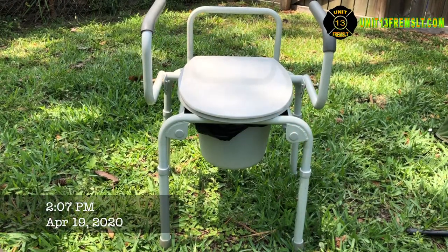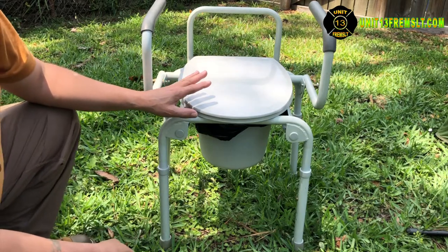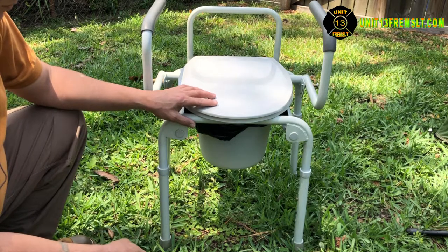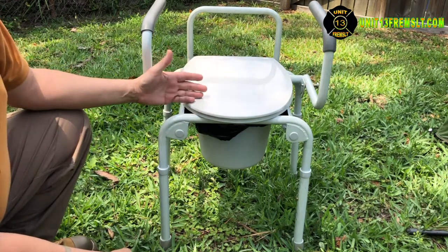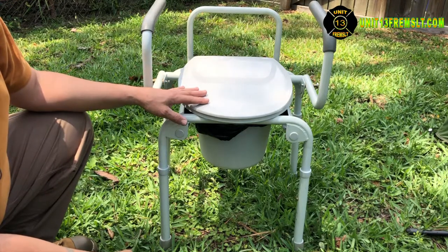Hello everyone, this is Unit 13 here on scene at the homestead. I want to share with you one of two different types of bedside commodes that we have on hand for emergencies. These things are really fantastic — they're designed to be set up by a bedside for someone who's convalescing at home so they don't have to go all the way to the restroom.